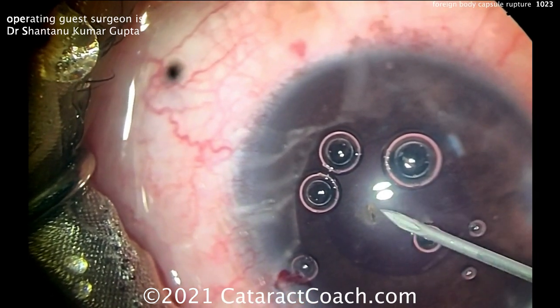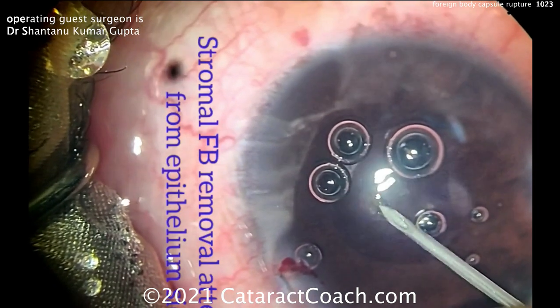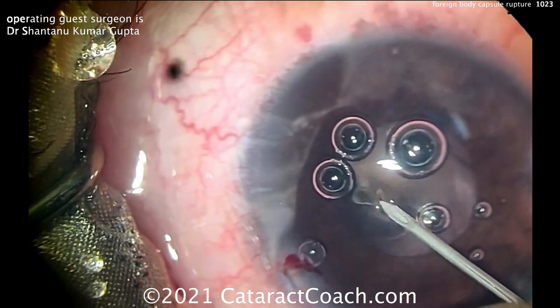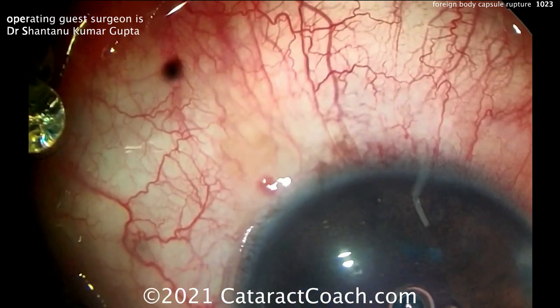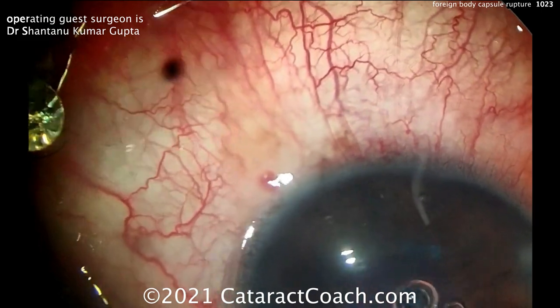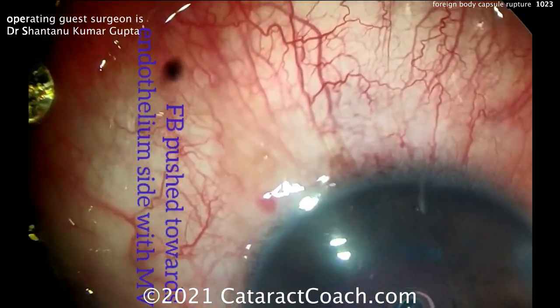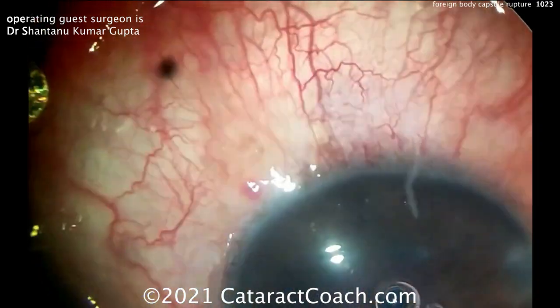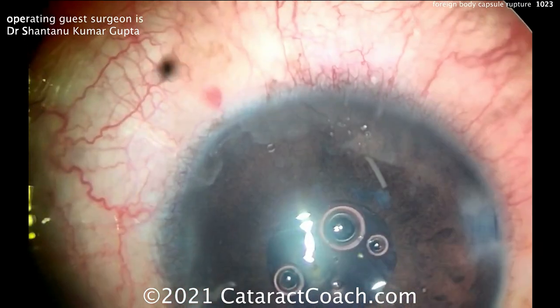Now for the foreign body — there it is. You can try to get it out from the front, but it's a little bit tough because it's so deep in there. You can use a small gauge needle here, or even an MVR blade — but it's still tough to get it out. So now he's going to push from the inside using an MVR blade. There we go — a little bit off screen — and once that's brought forward, it can then be pulled out of the eye.